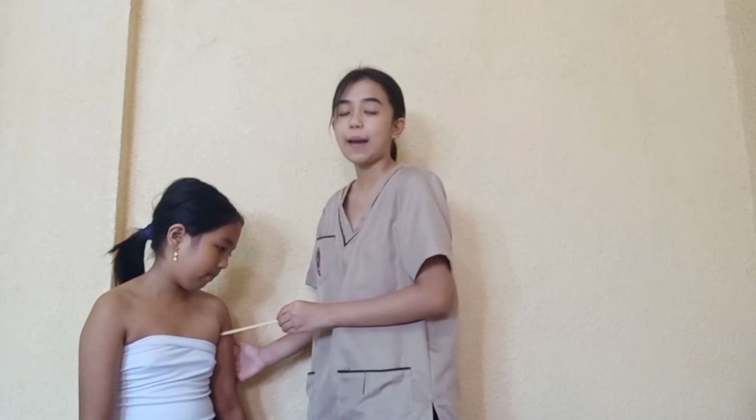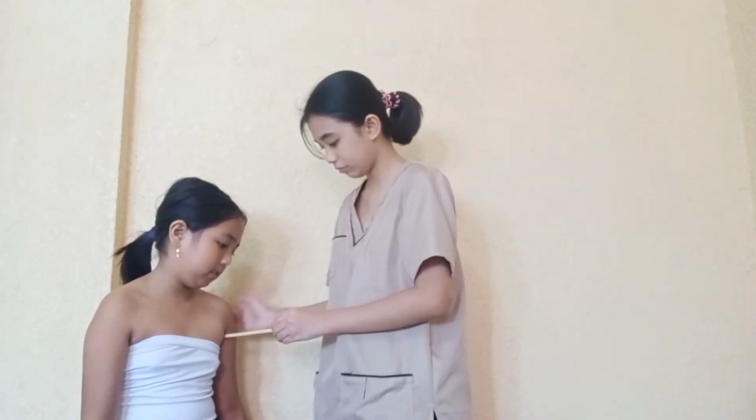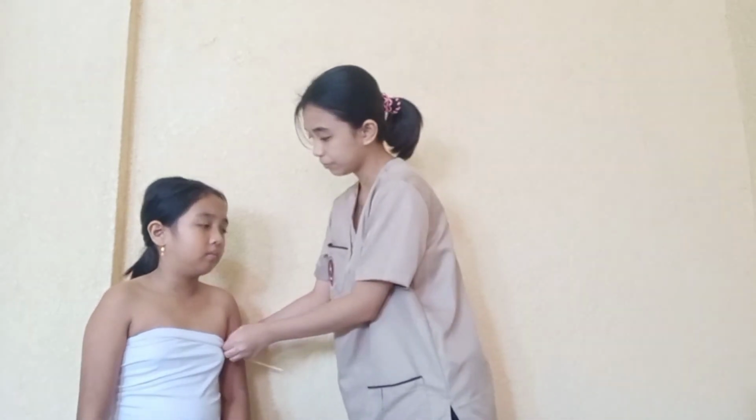After that, I'm going to hold in the probe and wait until I hear a beep. Then I'm going to carefully remove the probe and note the temperature reading. The temperature of my patient is 36.5 degrees Celsius. Next, I'm going to cover the patient and help her to a comfortable position. Ma'am, are you comfortable in your position now?